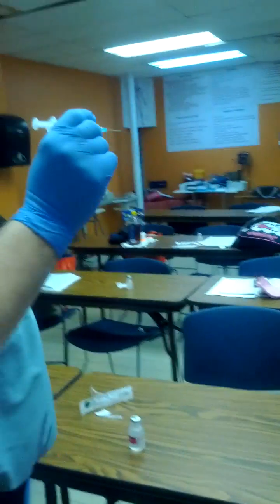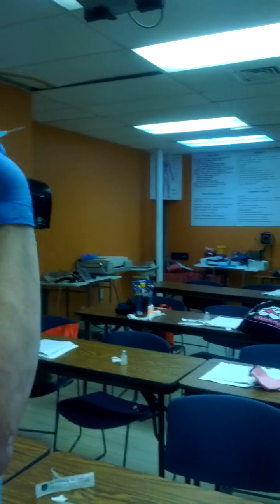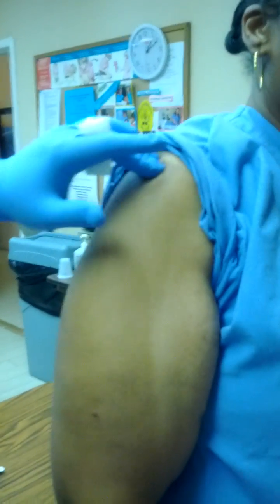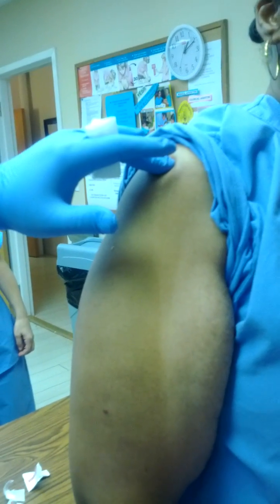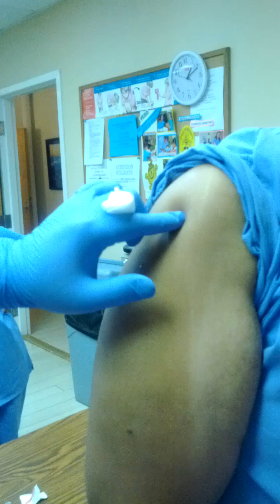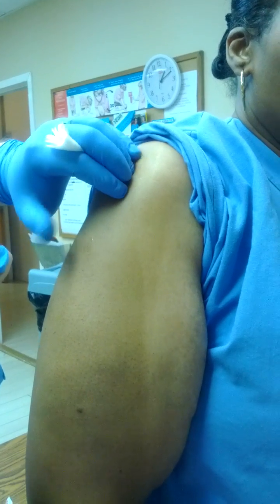Contrary to popular belief, these injections do not hurt if you do them right. The movement is with your fingers, just like a dart. You don't want to throw the dart from the elbow because what happens is that your elbow makes the needle arch. What you're doing is actually using your fingers to project it out further. Do not stand there and practice with the patient. The patient is not to look at what you're doing — people get slightly spooked with needles. For the site of the injection, we're going to find the bone that sticks out in the shoulder. This bone is called the acromion process of the scapula. I'm going to take my pinky, put it right on the very end, and go one, two, three finger lengths down from the acromion process — and that's going to be my site of the injection.